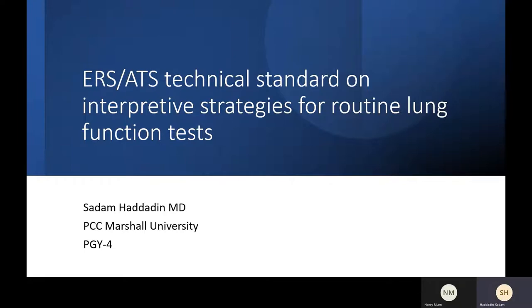Okay. And as you know, guys, the 5% or the Z-score of 1.645, this is the gray zone where it's normal or abnormal. It could be normal for the population, but it could also be abnormal in this 5%. If we take here the FEV1 for a patient age 22 years and another patient 88 years, and we compare it to the median for the upper or lower normal, this patient is far away from his predicted, and this one is almost near his predicted.